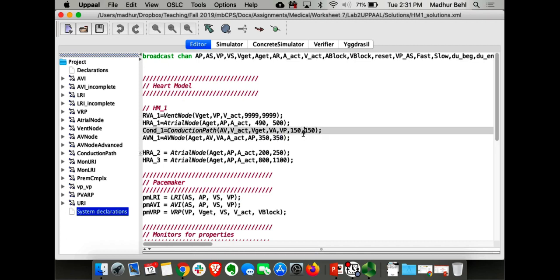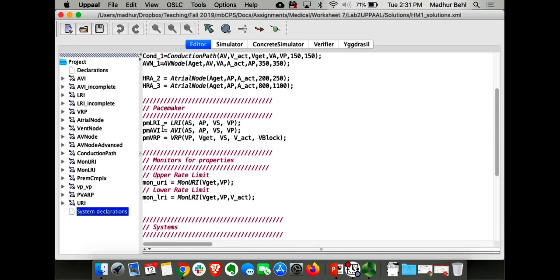So this is just like any object-oriented program. I've created 4 objects, each of them corresponding to the correct arguments that I pass. You don't have to change them during your homework, at least not the names of the signals. You may have to play with the values of the min and the max weights. So we have these 4 objects. Let's create a system now which has all these 4 objects.